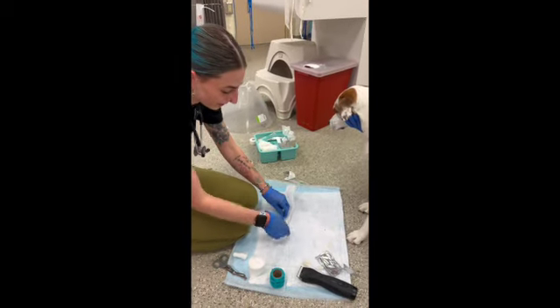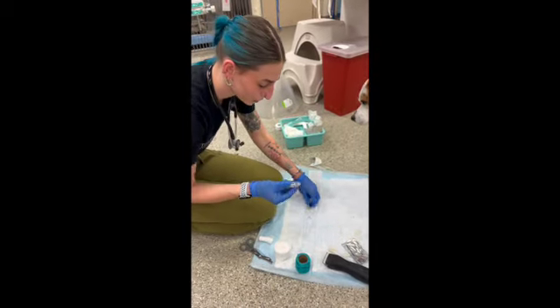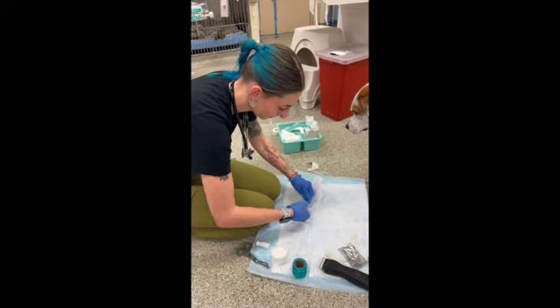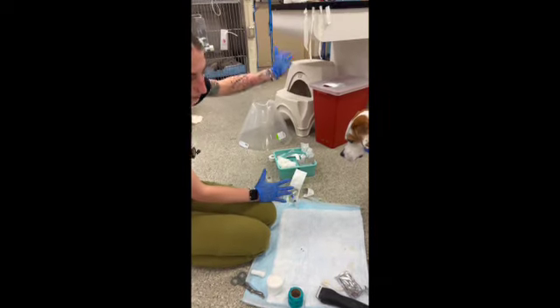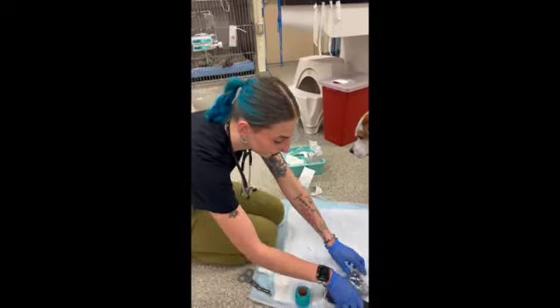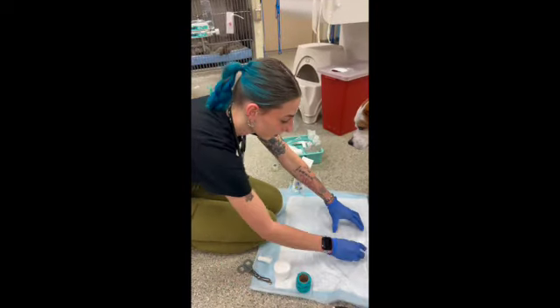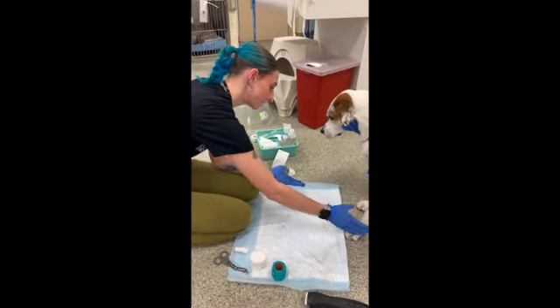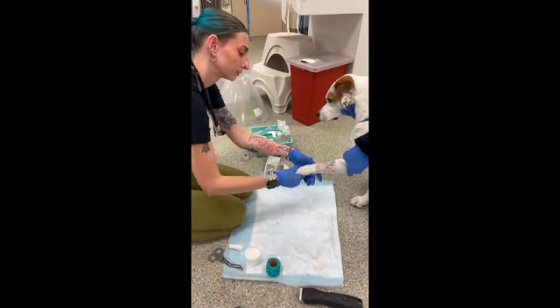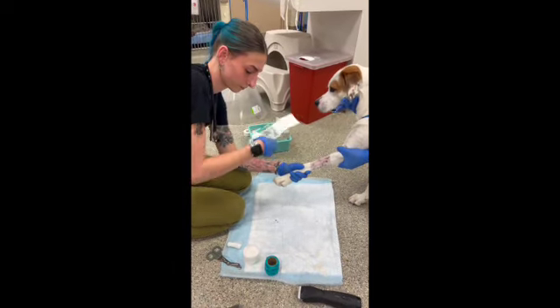I'm now just going to take my T-port and pre-flush it with some normal saline. I already have some tape torn and all of my wrapping items here. All right, you want to lay down or you want to stand, sweet girl?